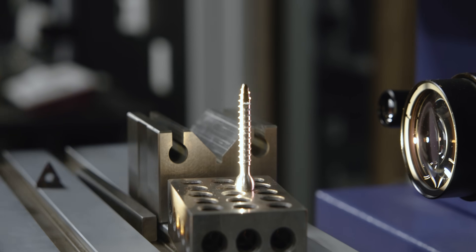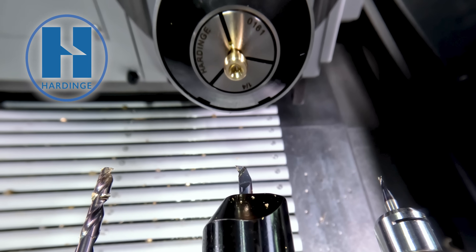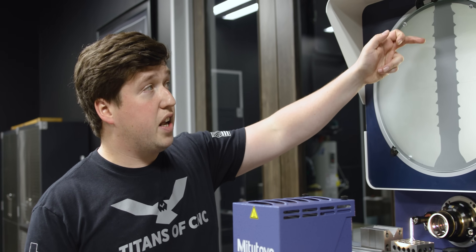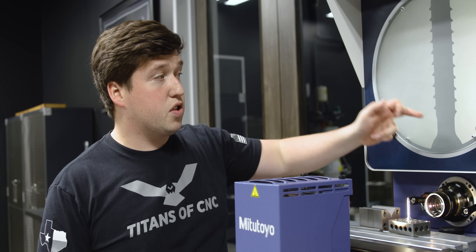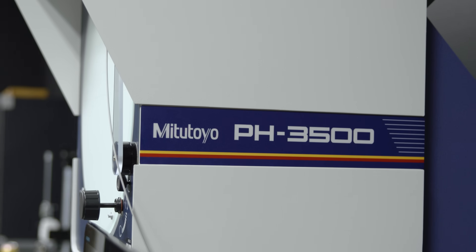One more thing before we get back to the machine — I'm going to put the bone screw on the shadow graph and show you how well it all blended together. I want to give TMS a huge shout-out for the titanium and Hardinch for the work holding on this job. With those two things I was able to get no blemishes on my part, which is pretty impressive because I do this in sections: the first section, the second section, and the third section. You can't see any blemishes — good job, guys. That's everything on the shadow graph; let's go back to the machine.